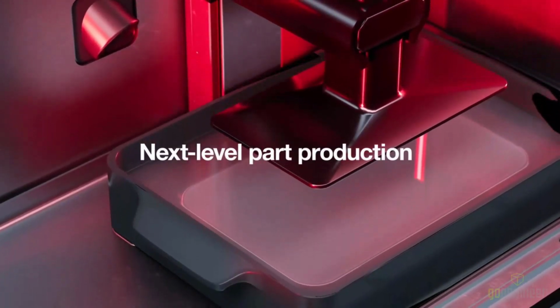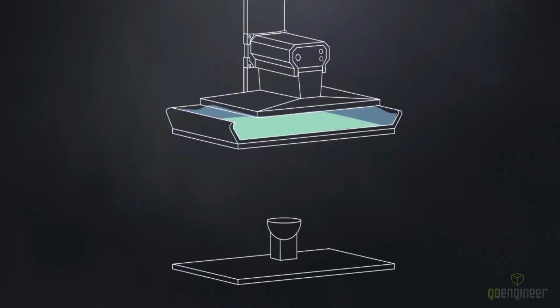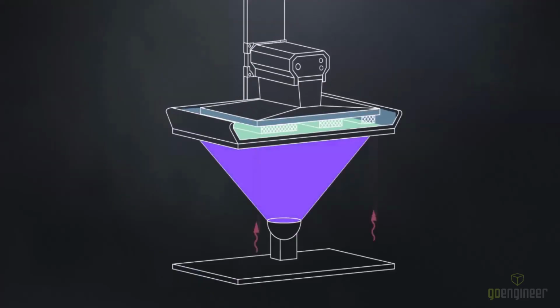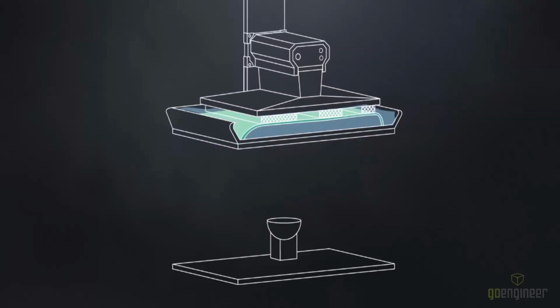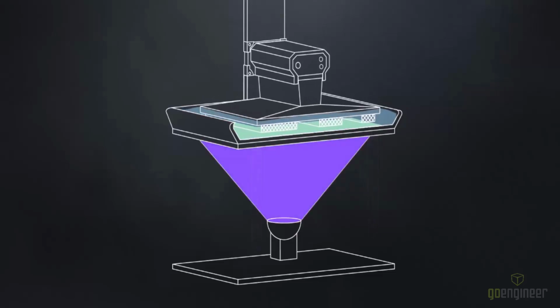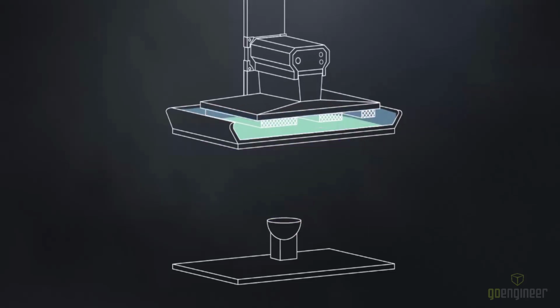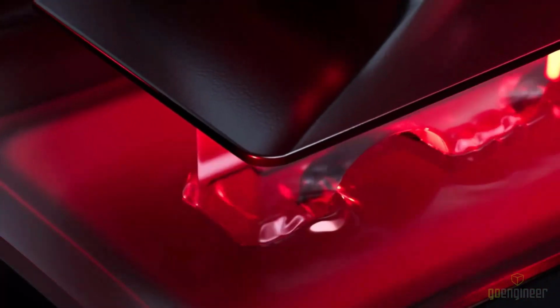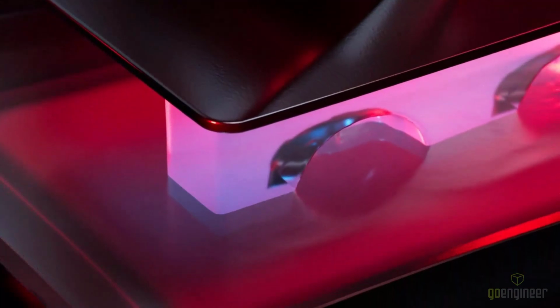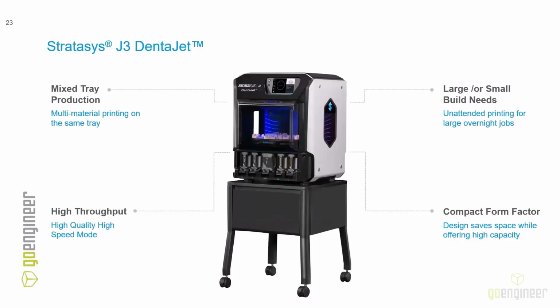Instead, they will lower a print head down to a vat of resin, and then it uses various forms of light, either a projector or a laser, to trace the vectors and rasters, the perimeter of the images of the parts onto the pool of resin, and then it will raise it up a tiny fraction of an inch, maybe 100 microns is pretty standard. And then it will do the next layer and then another 100 microns up and then the next layer.